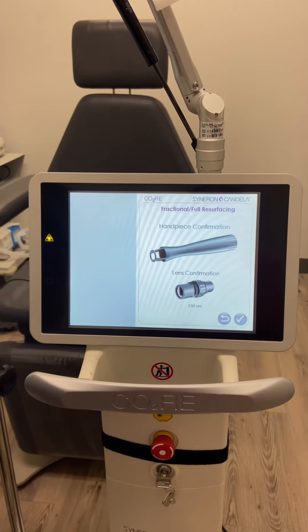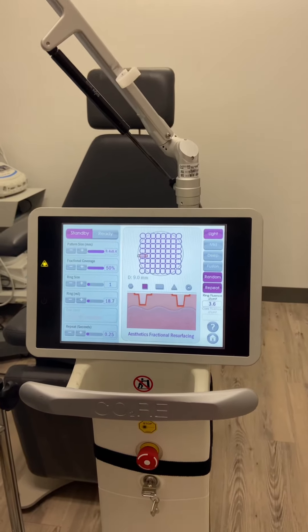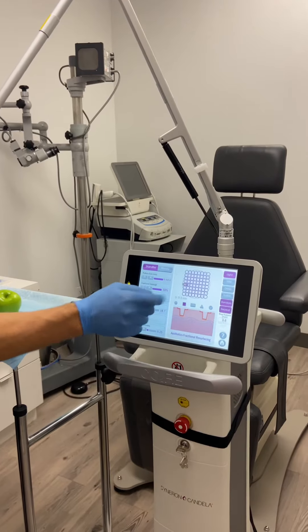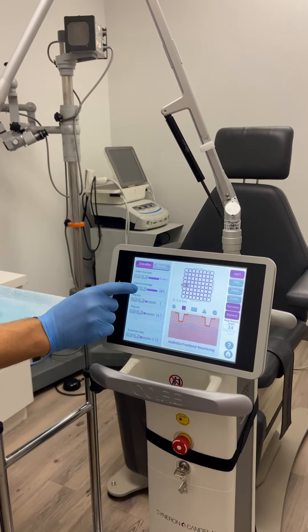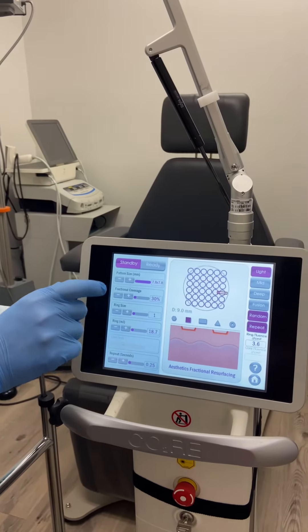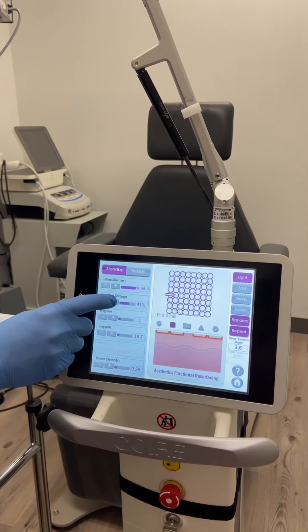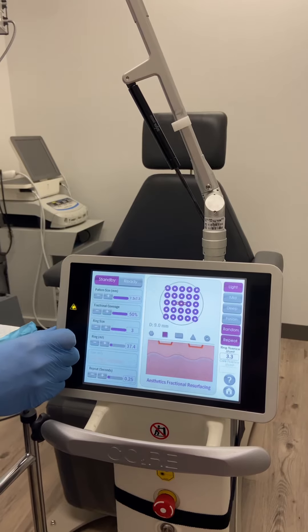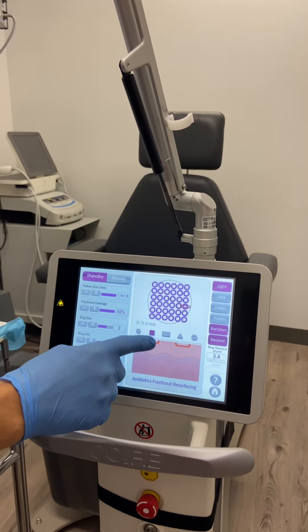Light mode is a very light resurfacing — you can think of this mode as basically what an Erbium-YAG laser would do. We have all the parameters here. We can set the pattern size, the fractionation coverage, so it goes up to 50% and all the way down to 30%. Depending on how much skin we want to resurface, we can change it. There are different ring sizes where we can change how much we remove. Ring two gives us a schematic in the skin of how deep we're going.